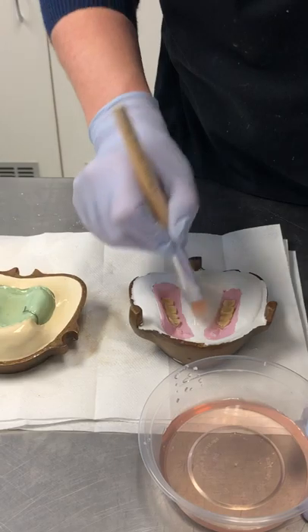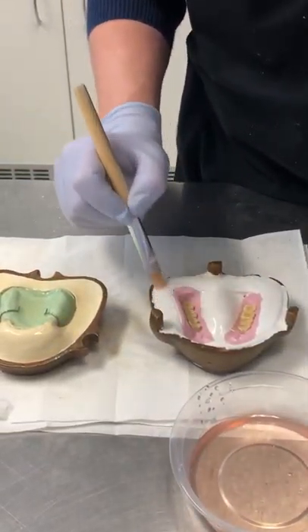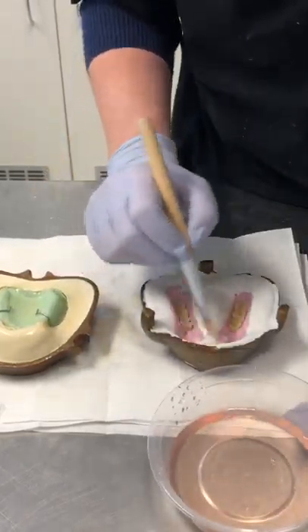On this side, you're painting the stone. No need to paint the putty or the teeth, but definitely all over the stone. And we're applying a couple of coats to this.